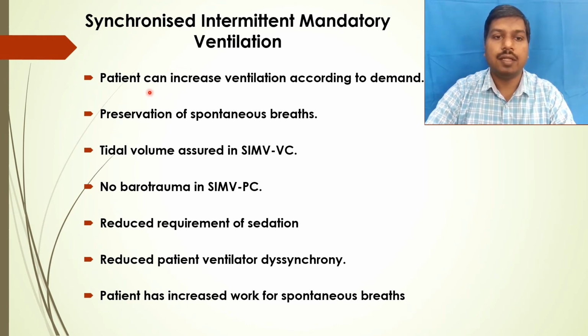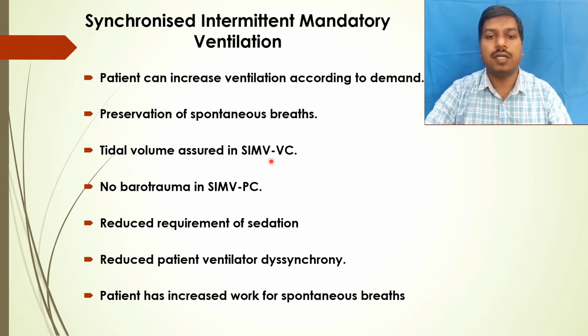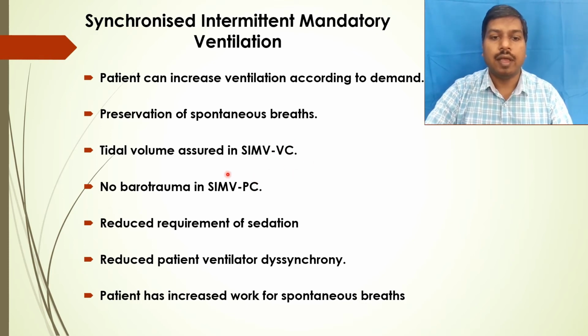Here the patient can increase the ventilation according to demand. There is preservation of the spontaneous breath. The tidal volume is assured in synchronized intermittent mandatory ventilation in volume control mode. And there is no risk of barotrauma if it is in a pressure targeted ventilation. And there is a reduced requirement of sedation, reduced patient ventilator dyssynchrony, and patient has increased work for spontaneous breaths.